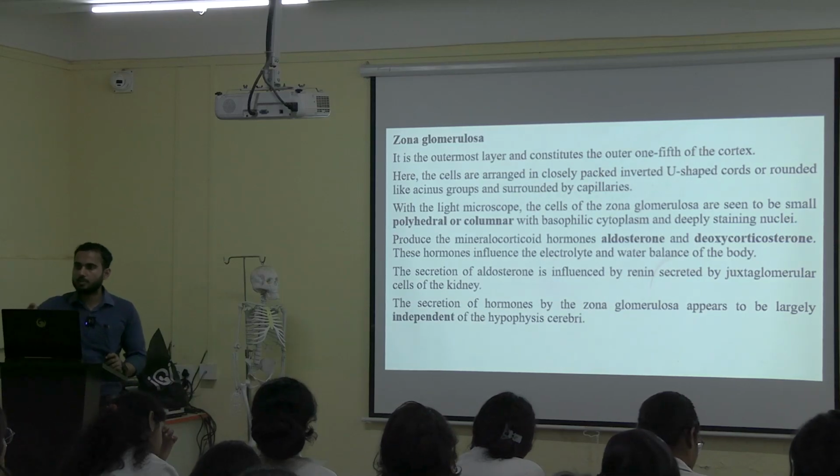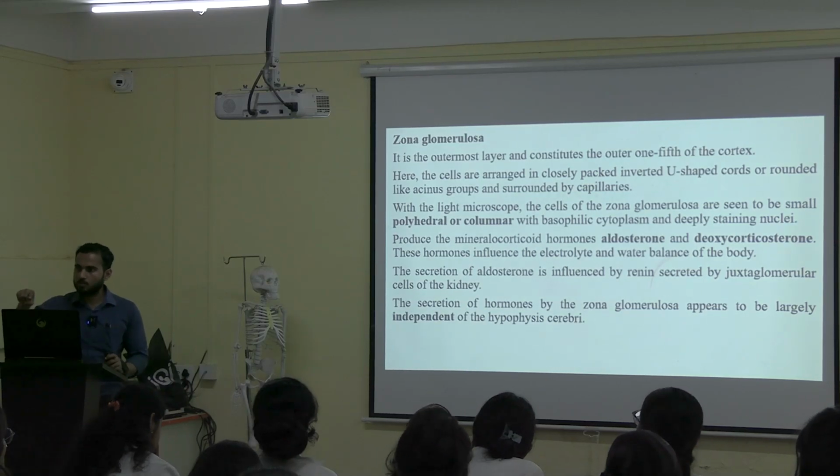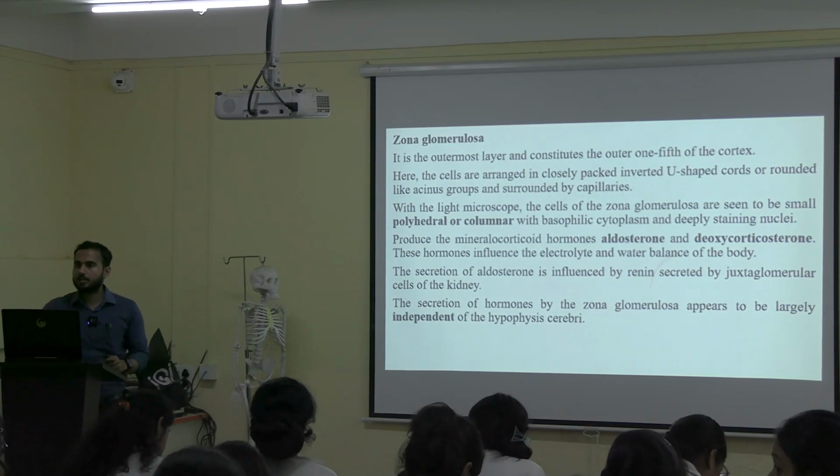Inverted U shape. I hope you know U. Turn it upside down, so that is the inverted U.